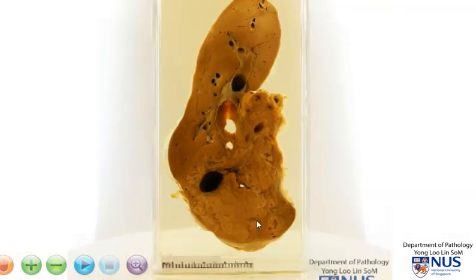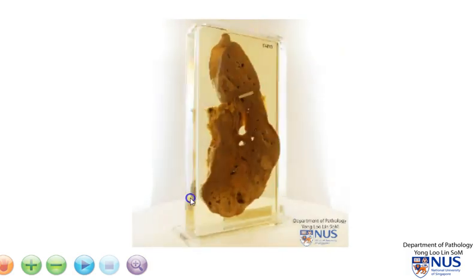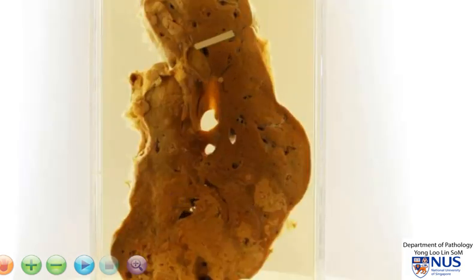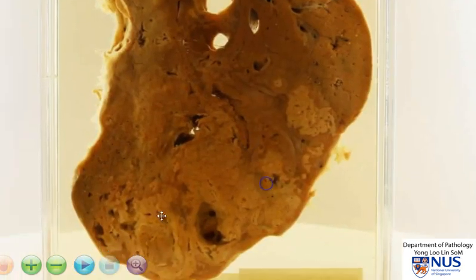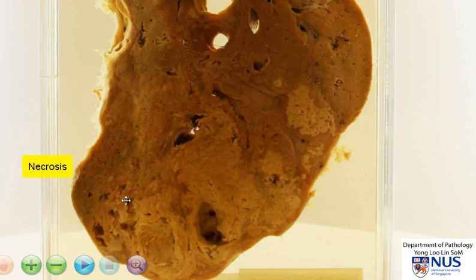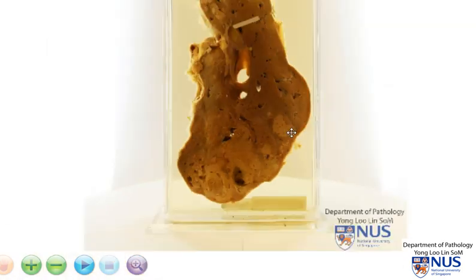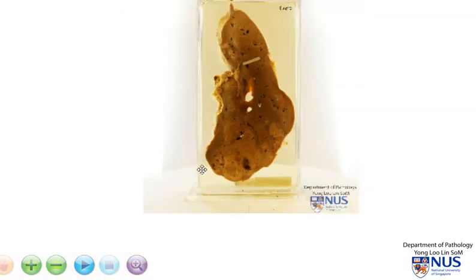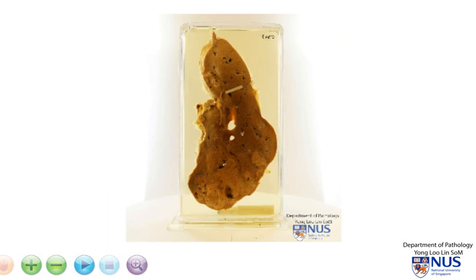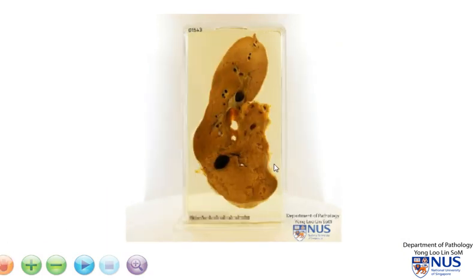At the same time, we also see some paler areas, and these are actually seen better on the opposite surface. Looking at these paler areas within this tumor mass, these actually represent areas of necrosis. Hence, we're looking at a large tumor in the liver, and this is an example of an intrahepatic cholangiocarcinoma.